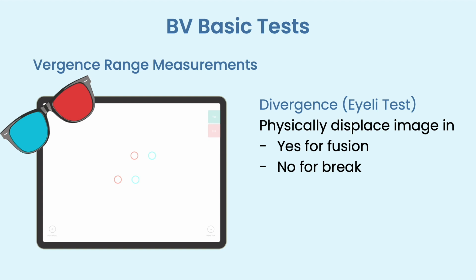Again, we do divergence before convergence. And the convergence test works in exactly the same way. Again, we see if the patient can fuse the images and then press yes or no.